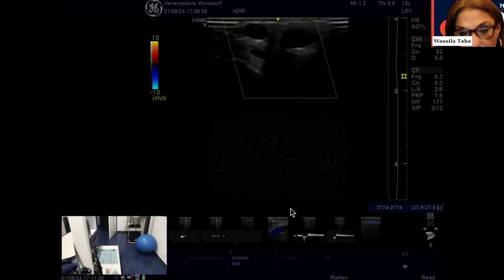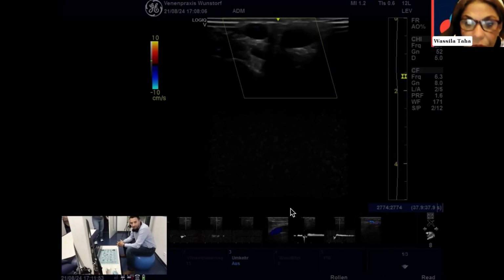There is some question about the technique, Erika, how to make the ultrasound window larger and the window with the moderator smaller. This is very simple. With the button on your machine, you can adjust your color box very easily. Once you know the button and you change the color box, you will see your vein better.